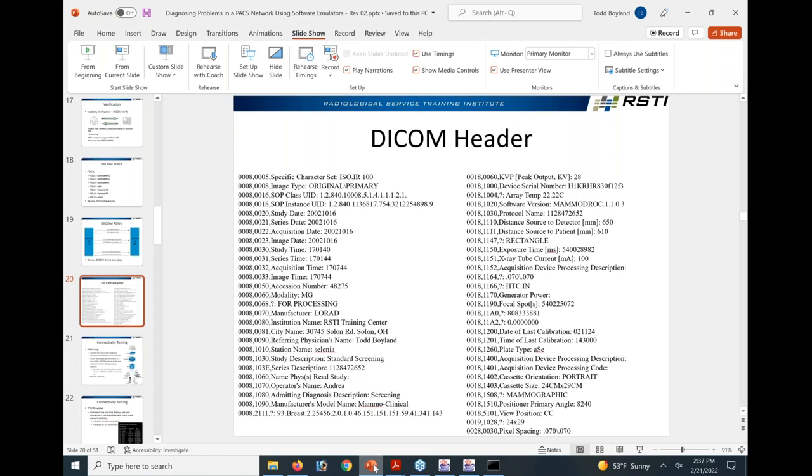What PDU is all this part of? PDU4. Who was saying it though, user or provider? The provider, because the user doesn't know if it was successful. Only the provider can know. That's the handshake, right? PDU1, PDU2, everything's request, response, request, response, request, response. And then at the very end, PDU5 and PDU6. Actually, I don't see a PDU6, I see a PDU5. Yeah, there should have been a 6 below there, so you got cut off.